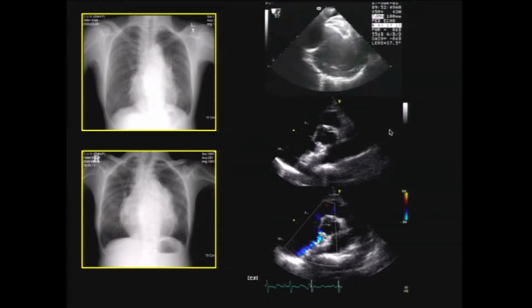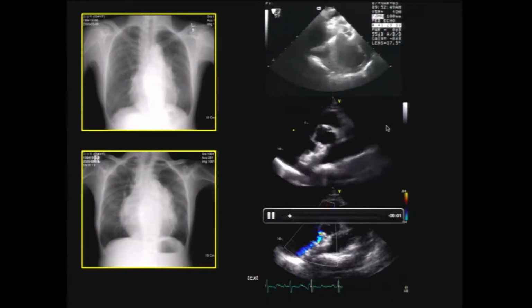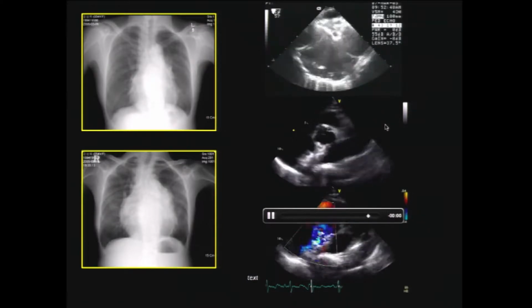At the beginning, the ASD device is well aligned, splaying over the aorta posteriorly, but 2 months later, it's flattened because it is a memory alloy, and especially the RA disc pinches the aortic wall posteriorly.